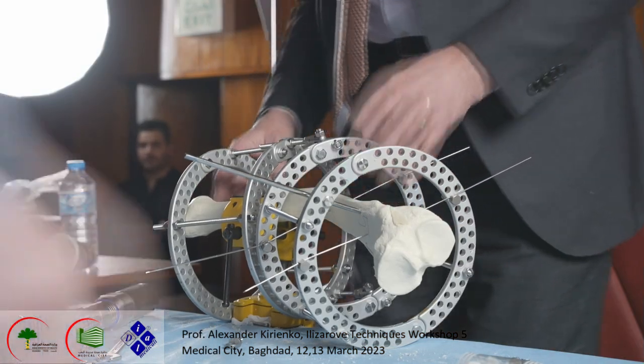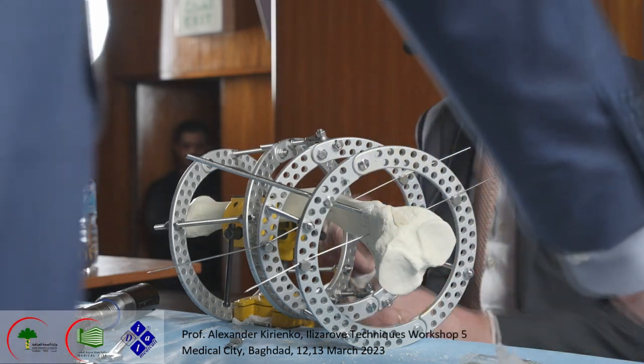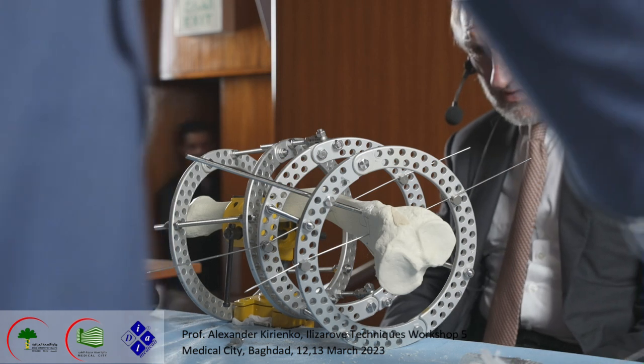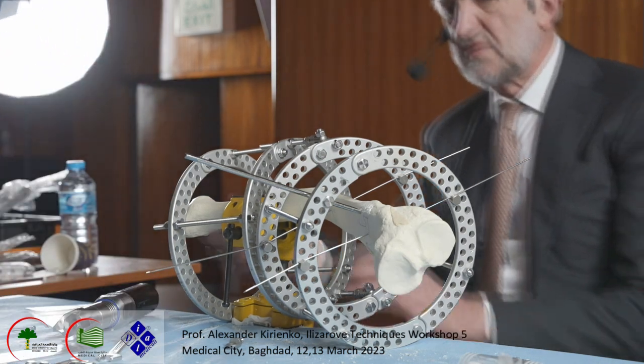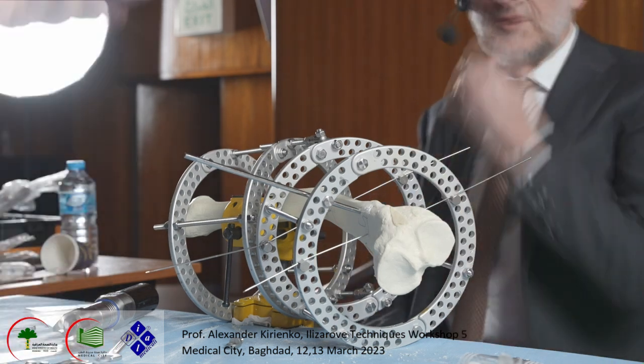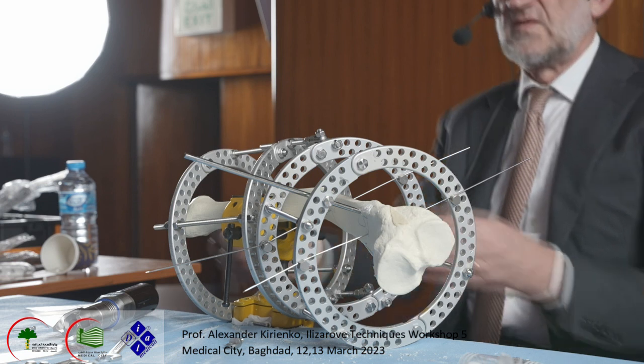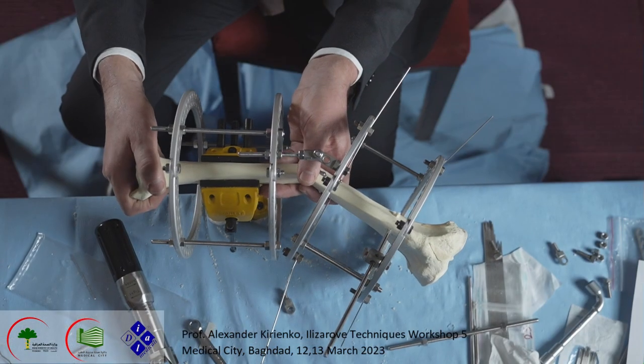We see that it's realigned to the distal fragment, and now we use a wire, a non-olive wire for now. Simple, smooth wire. Okay. I hope you see it, system.